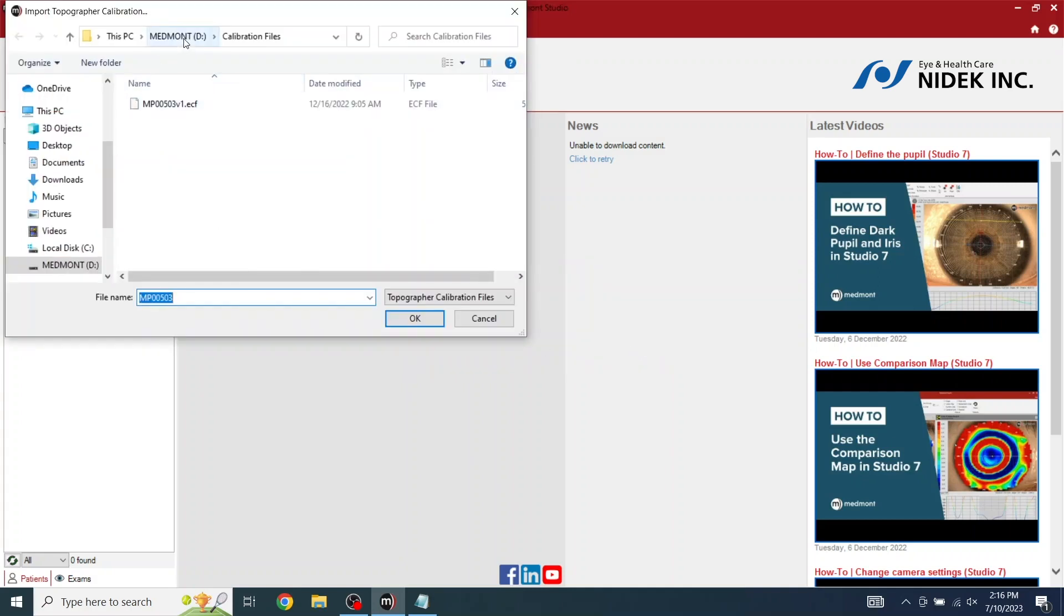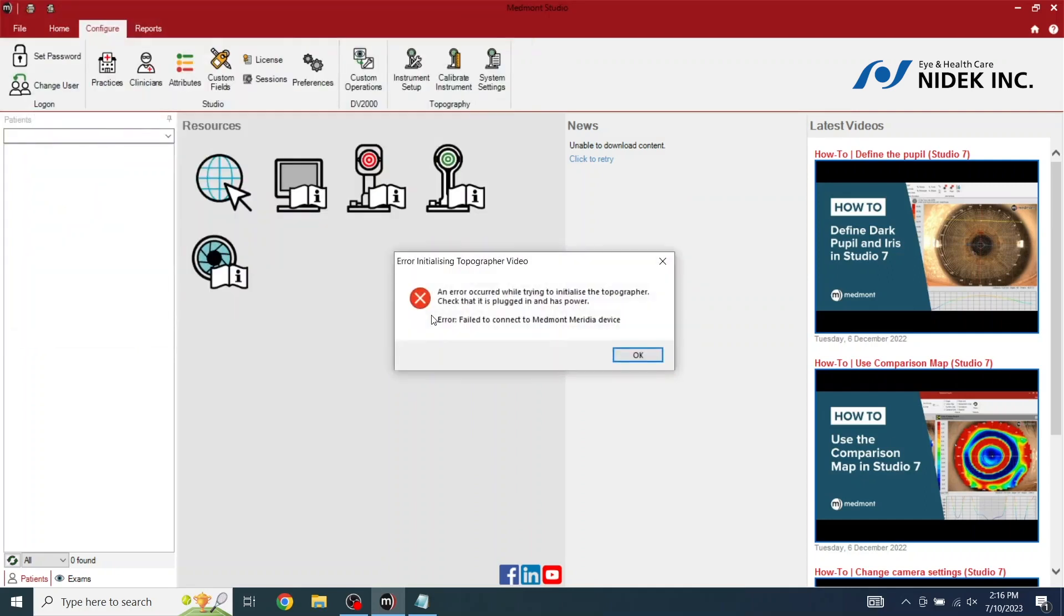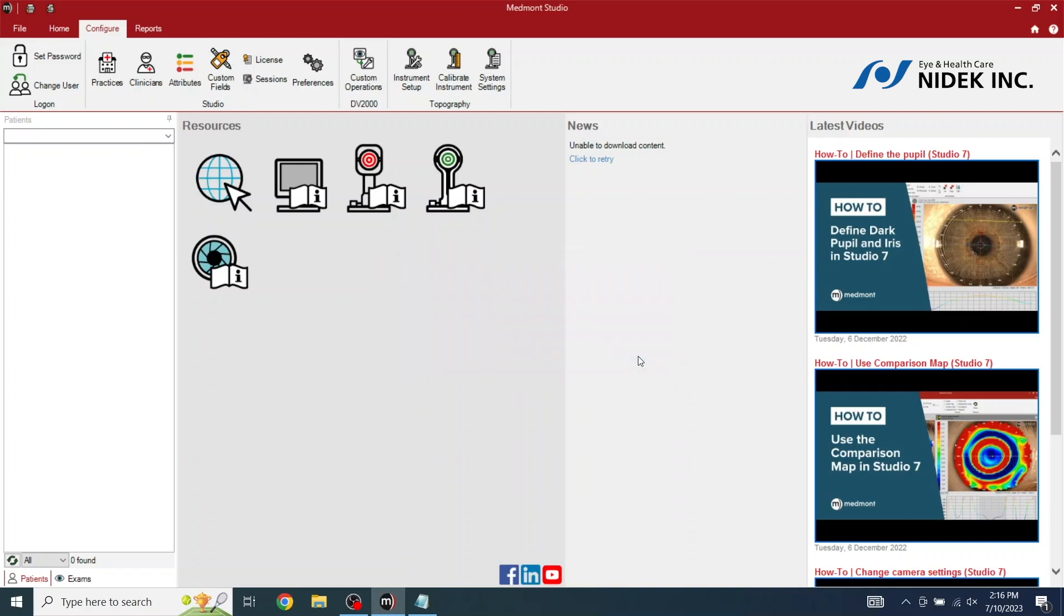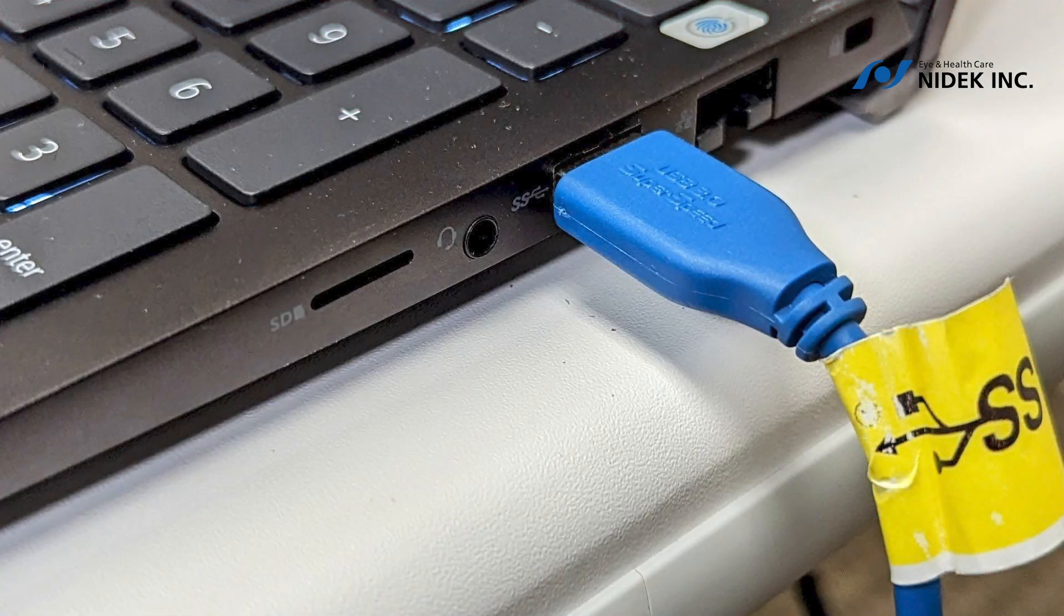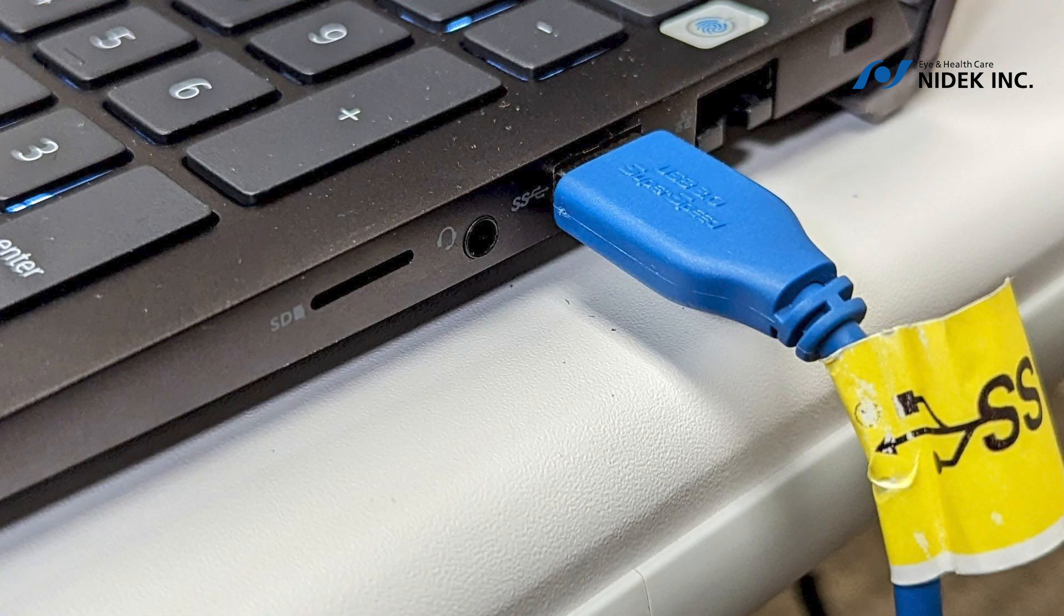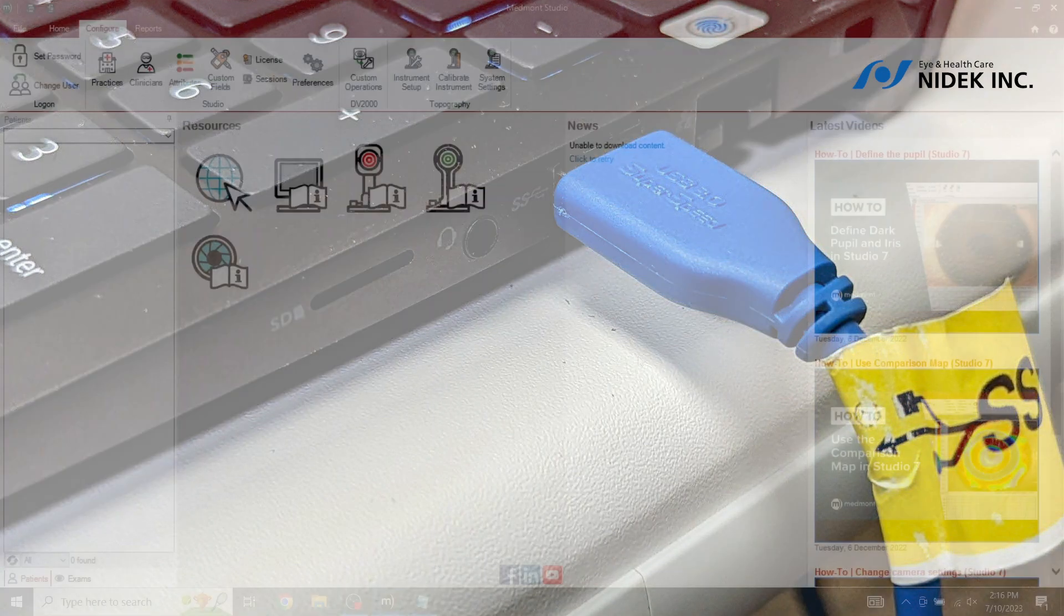We're going to go into Medmont. Under Calibration Files. And we're going to select the calibration file. And select OK. As you can see, an error occurred while trying to install the topographer. Check that it's plugged in and has power. At this point, we're going to select OK. We're going to plug in the topographer. The blue USB cable into a 3.0 USB port.